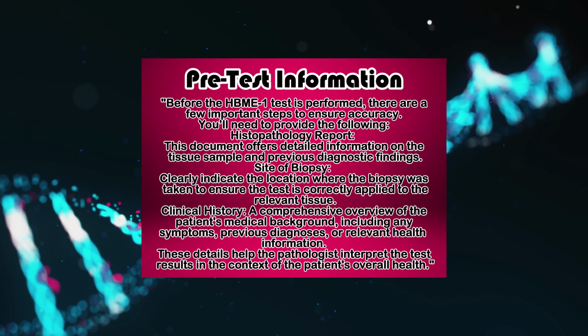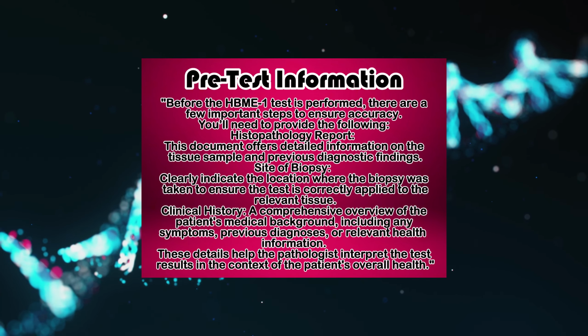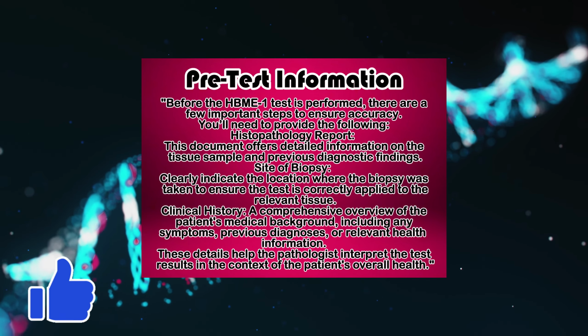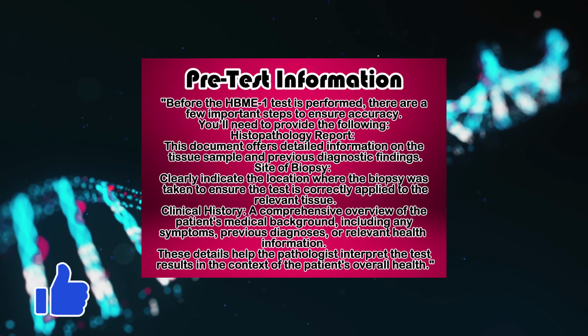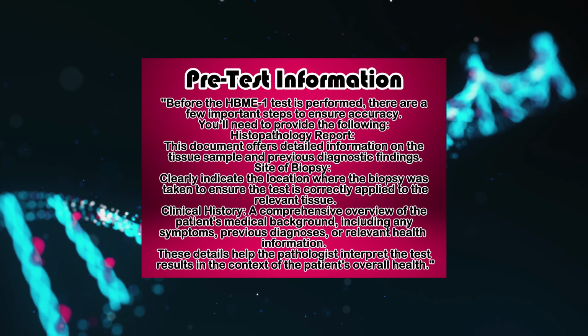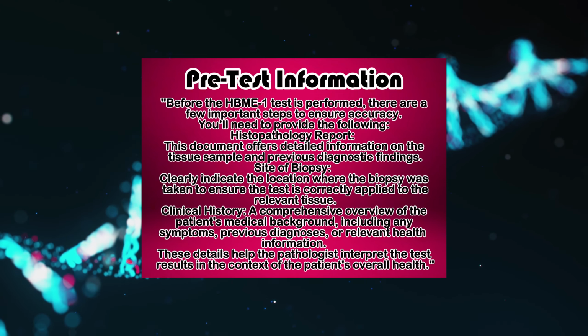the relevant tissue. Clinical history. A comprehensive overview of the patient's medical background, including any symptoms, previous diagnosis, or relevant health information. These details help the pathologist interpret the test results in the context of the patient's overall health.